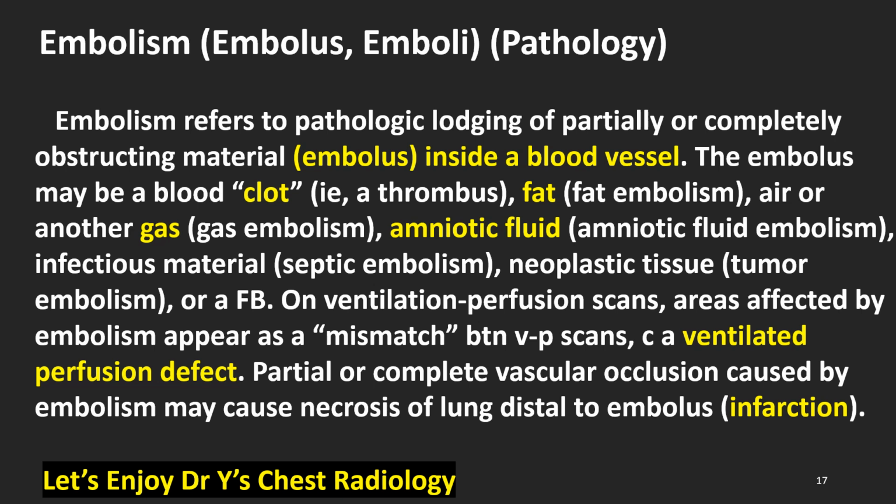On ventilation perfusion scans, areas affected by the embolism appear as a mismatch between V/Q scans with a ventilated perfusion defect. Partial or complete vascular occlusion caused by embolism may cause necrosis of lung distal to the embolus, infarction.